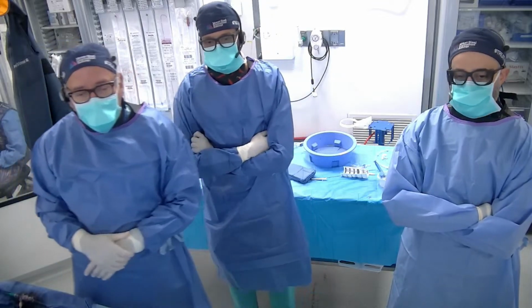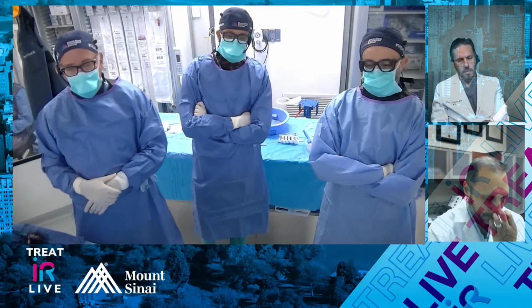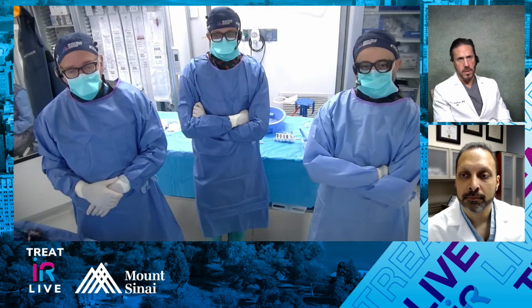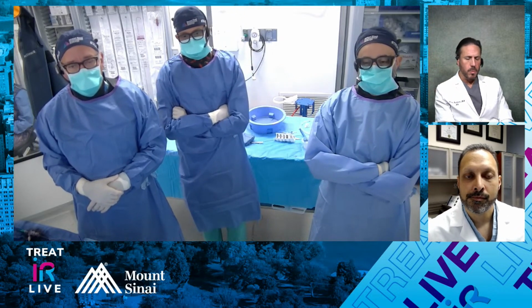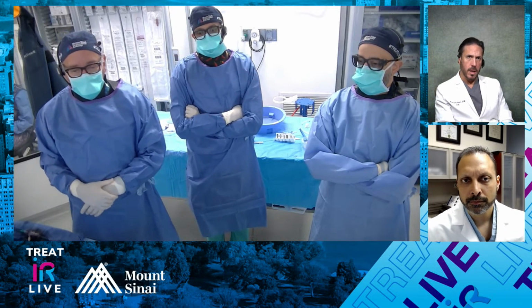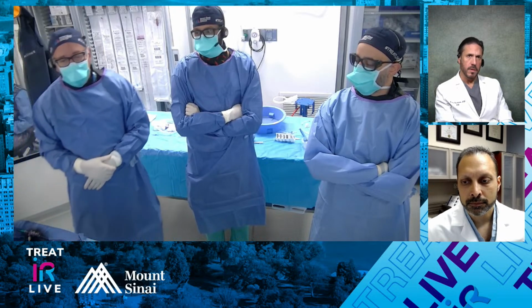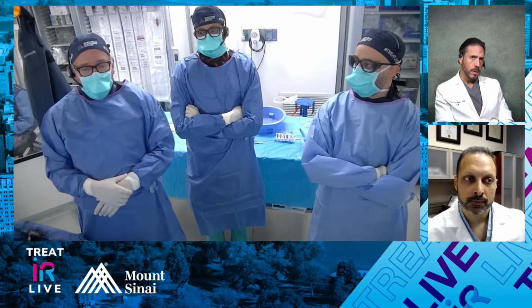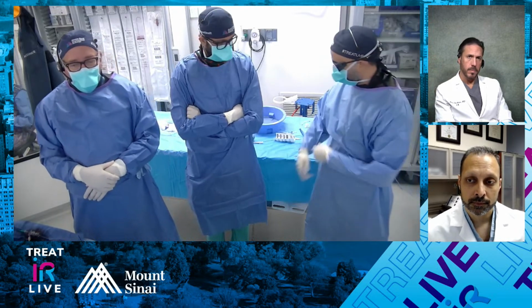Rob, can I ask you a quick question before you move? Sure, go ahead. This is obviously a different case because it's non-atherosclerotic, but what's your experience in multiple renal arteries and atherosclerotic disease and stent? Do you find that if you leave one artery that has disease in it, you're going to end up with a minimal impact on the blood pressure?